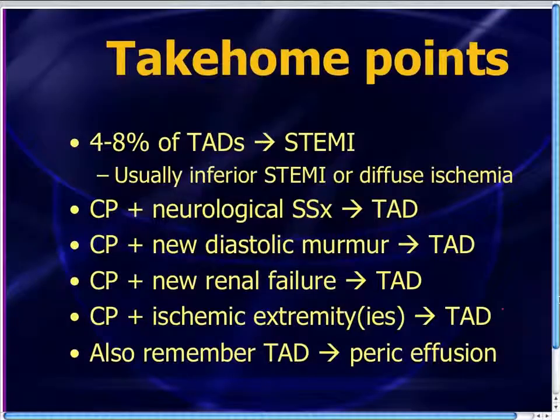And that's why it's really important to remember this. So some quick take-home points. This is a great case that Lamar sent us because it gave us a chance not only to look at an EKG, which is honestly pretty easy in this case, but also to review something that can sometimes be associated with the nasty-looking EKG, and is certainly in that differential for anybody with chest pain.